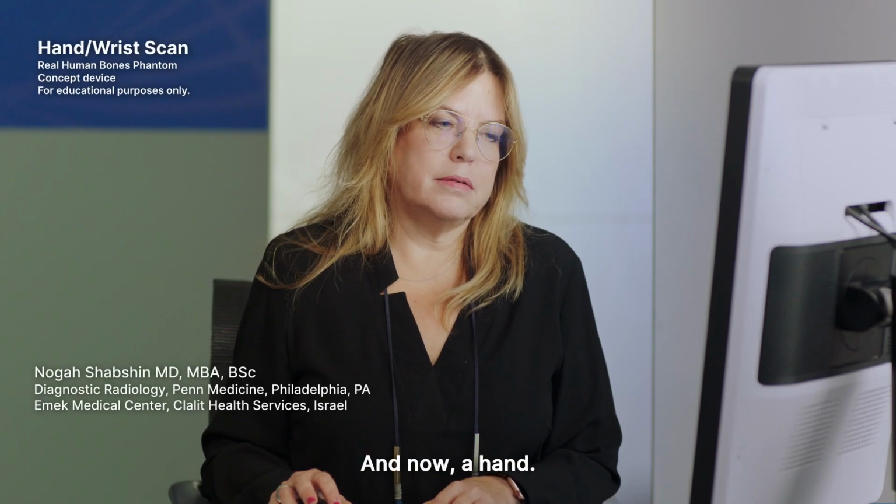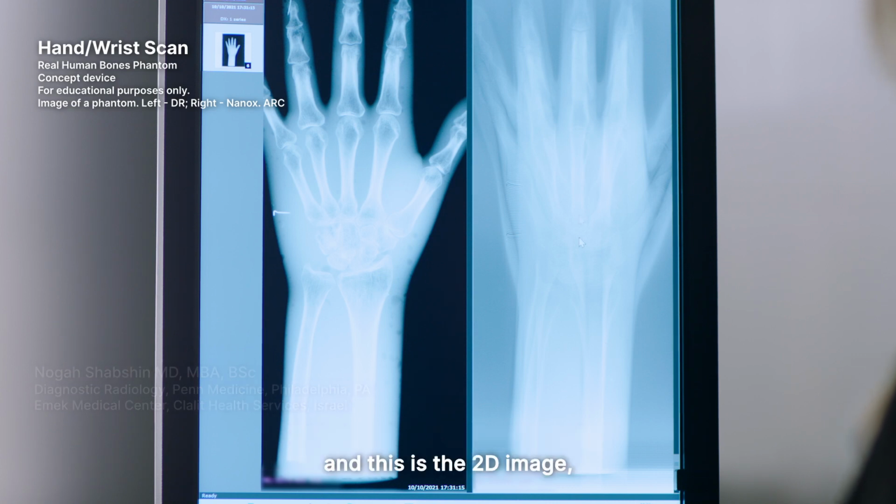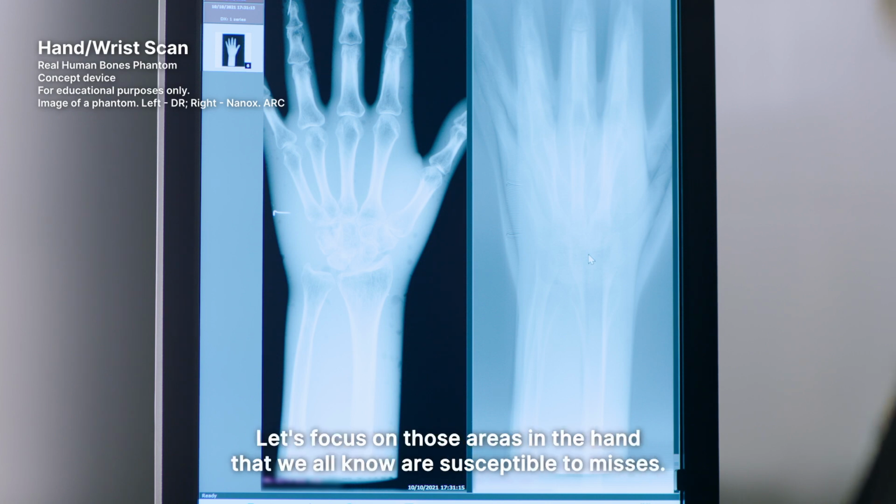And now a hand. This is a phantom that contains a real human wrist and hand. And this is the 3D, this is the 2D image, and this is the 3D tomosynthesis study. Let's focus on those areas in the hand that we all know are susceptible to misses.